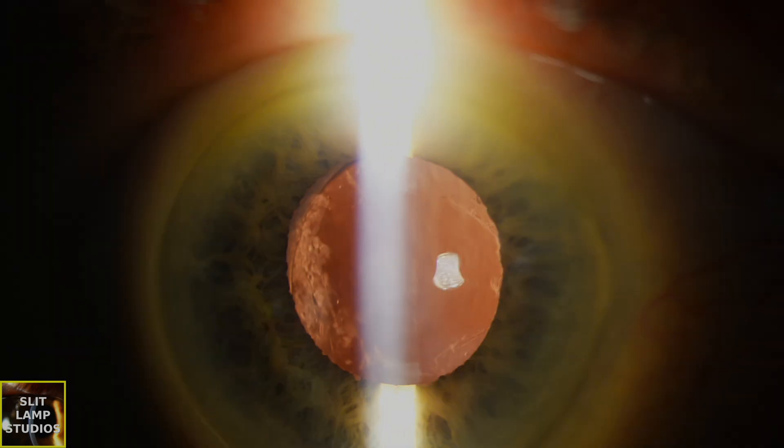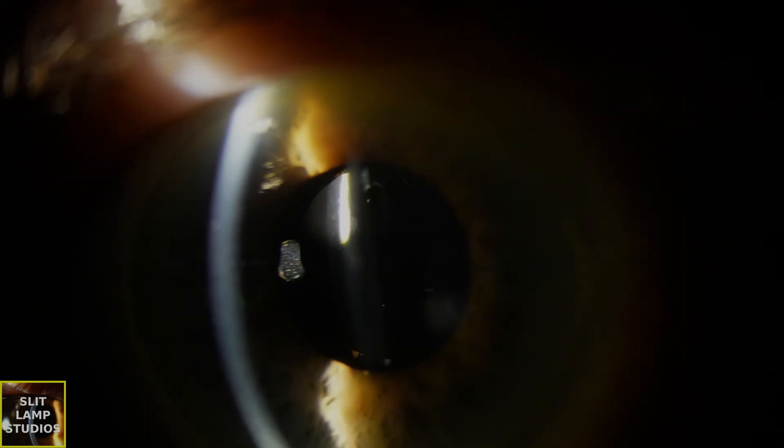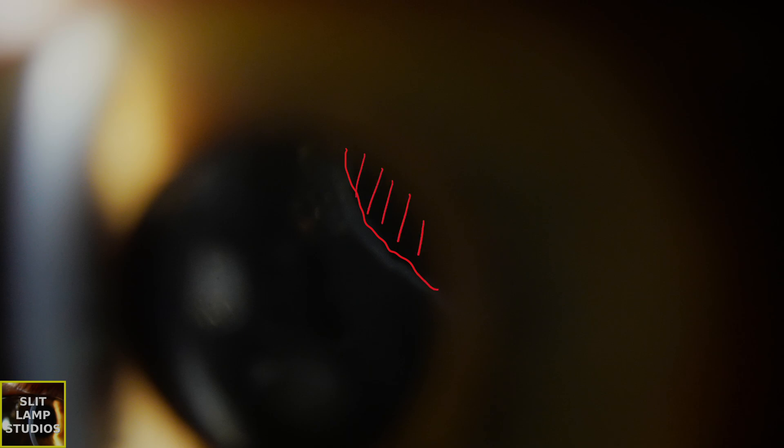I can already answer that question. So let's focus in on that vitreous. This patient's pseudophakic. There you go — so that's your posterior hyaloid membrane there, and there's some optically empty space behind that. So does that help you in any way?